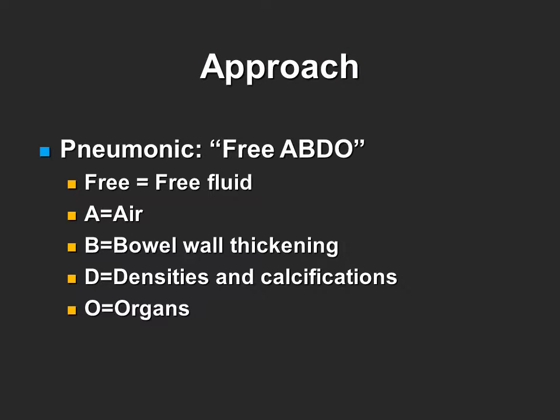In order to remember the approach to abdominal plain films, remember the mnemonic, FREE ABDO. The F stands for free fluid, the A stands for air, the B stands for bowel wall thickening, the D stands for densities and calcifications, and the O stands for organs.